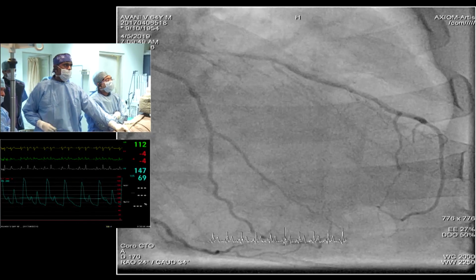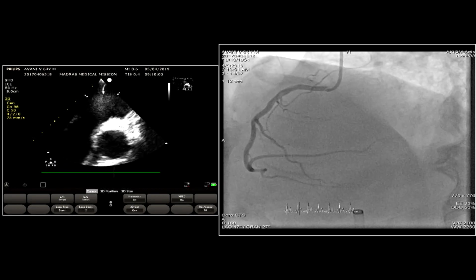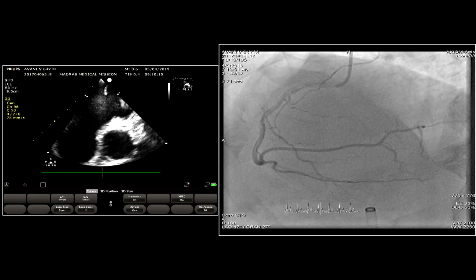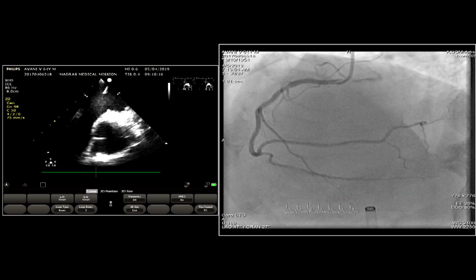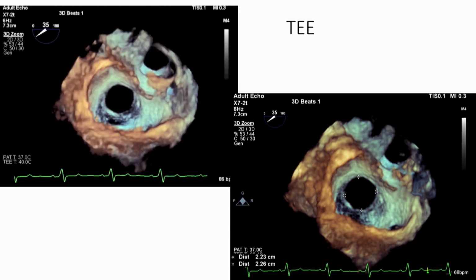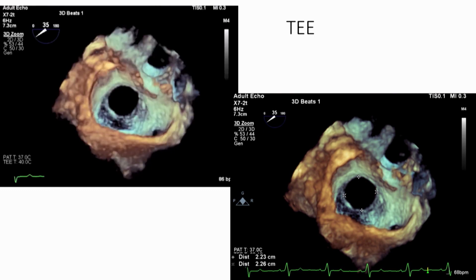Do you think it's just one large hole, or a small fenestration? The question from the audience is, is this one large hole, or are there multiple fenestrations? Actually, it is one single large hole. Show the transesophageal once again. Probably echo dropout at the site where the inferior portion of the fossa ovalis is very thin, and that is giving those appearances. However, it is more of a circular defect of somewhere around 23 millimeters.